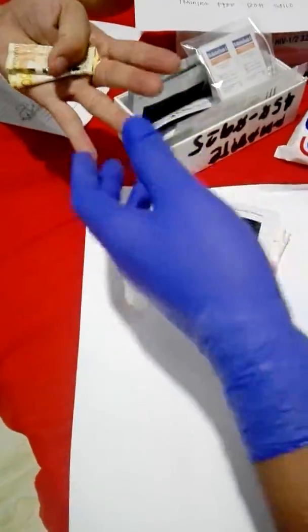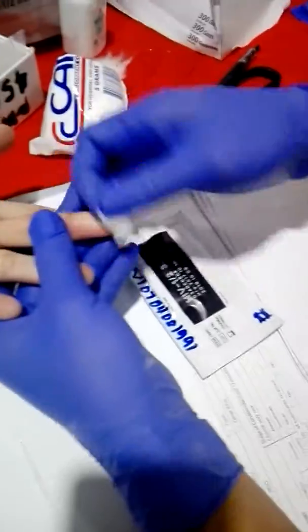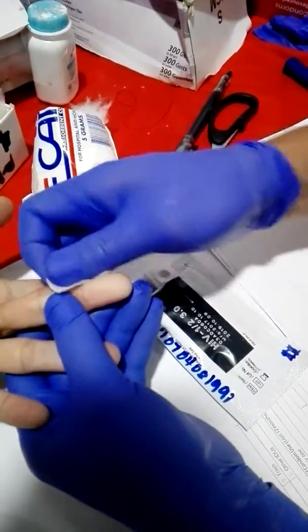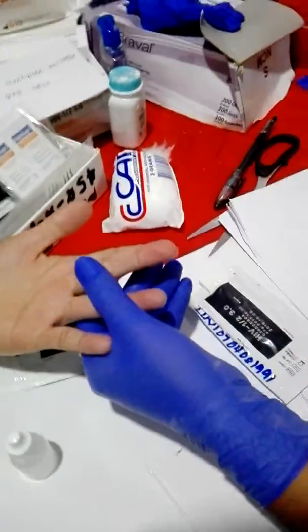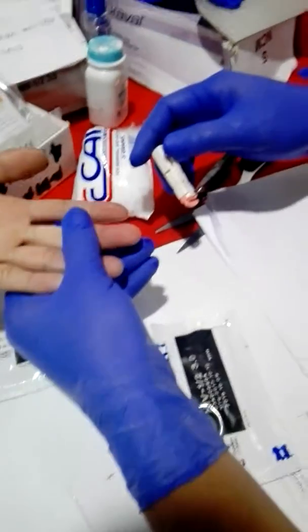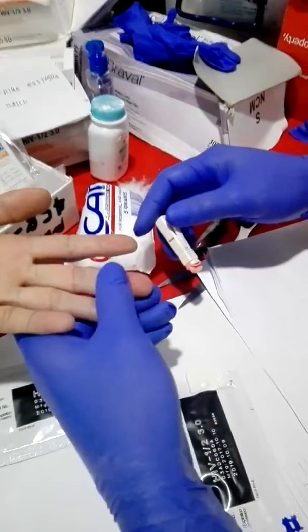So you get the hand, or choose a finger. It could be the middle finger, whichever you want. Now use the alcohol swab in order to cleanse it. It is very important to sanitize it to prevent bacterial contamination. After that, we use the lancet. That's the lancet. It's responsible for pricking the area where we need to gather the specimen. There you go.